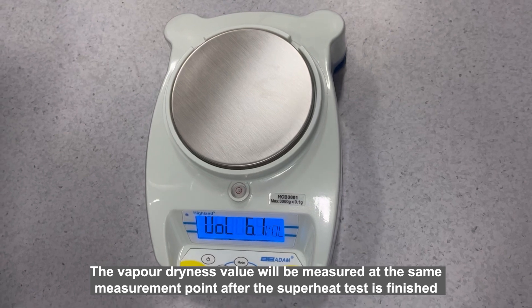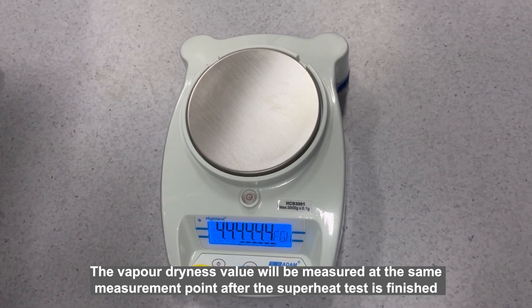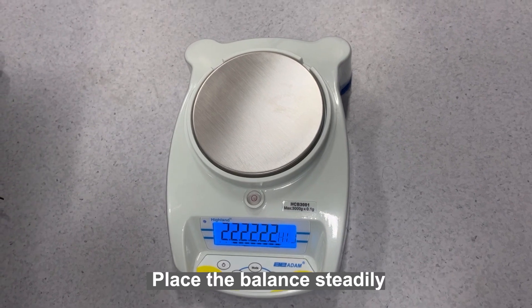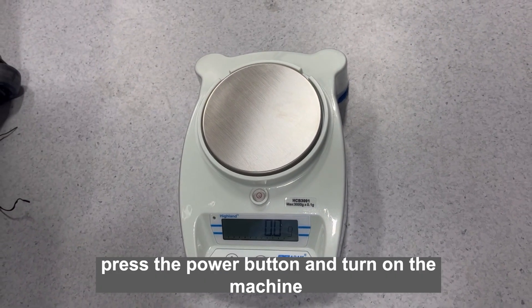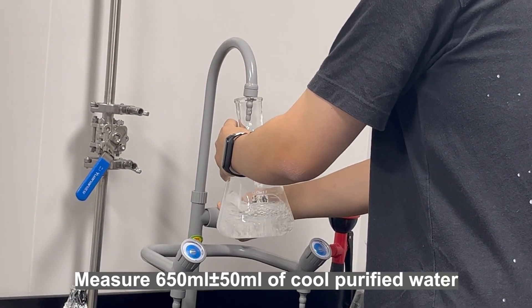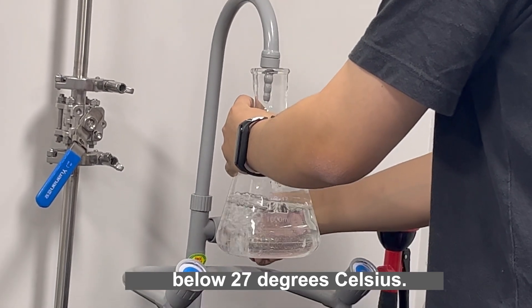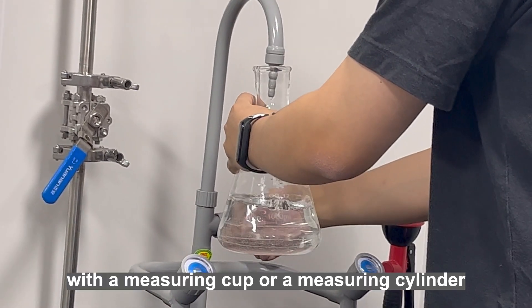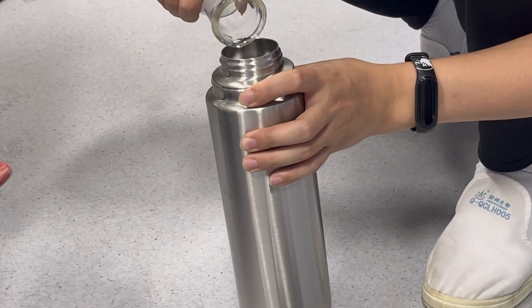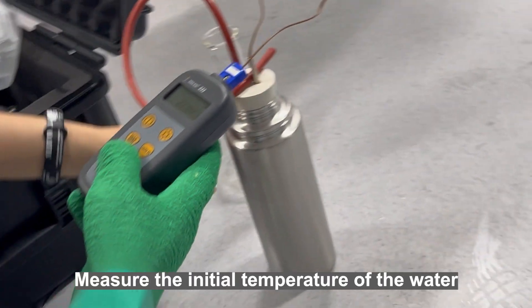The vapor dryness value will be measured at the same measurement point after the superheat test is finished. Place the balance steadily, press the power button, and turn on the machine. Weigh the empty bottle. Measure 650 ml plus or minus 50 ml of cool purified water below 27 degrees Celsius with a measuring cup or measuring cylinder. Pour it into the vacuum bottle. Weigh the weight after adding water. Measure the initial temperature of the water.